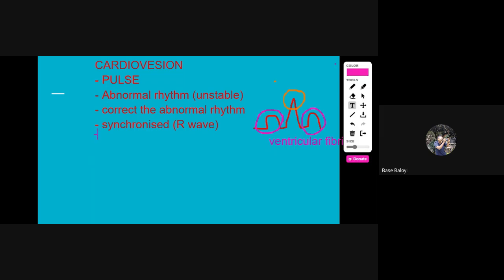And remember that before cardioversion can be done, you don't just say, oh, my patient is unstable, let's get ready for cardioversion. No, a TEE or TTE must be done. TEE stands for transesophageal echocardiogram. TTE stands for transthoracic echocardiogram.